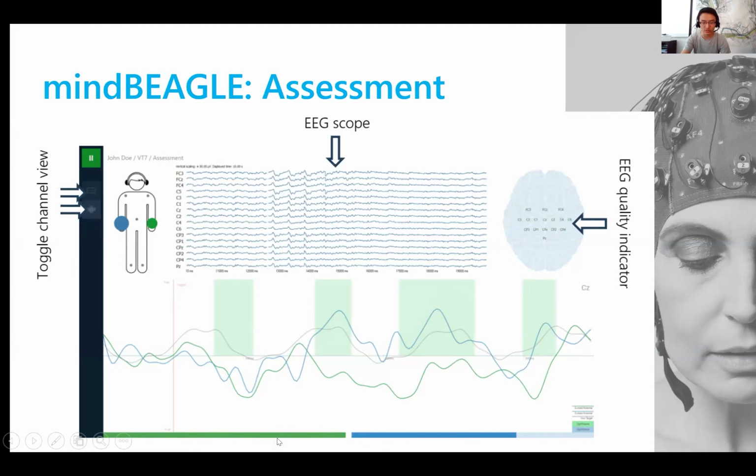And this corner also matches with the tactile stimuli. For example, at the beginning, here, this green corner matches the green circles here. Which means at the beginning, the target is on the left hand. And then it will change to the right hand, which matches the blue corner here.